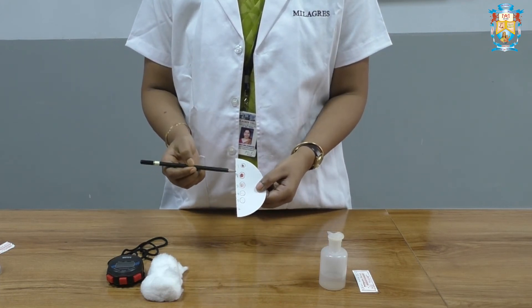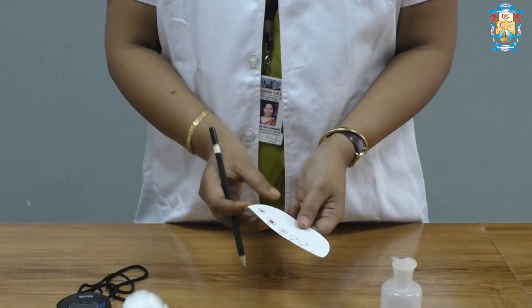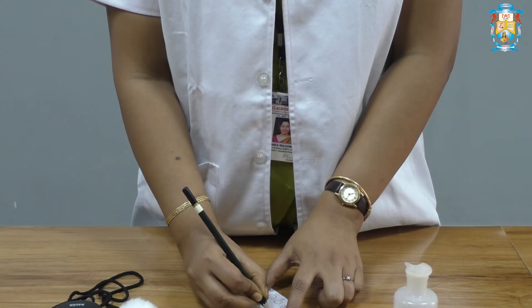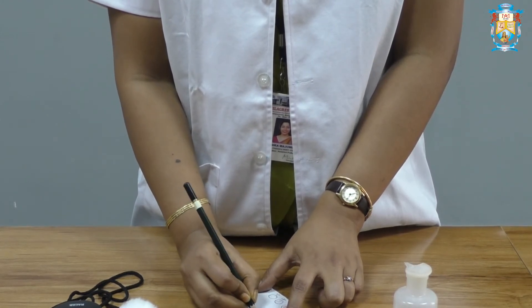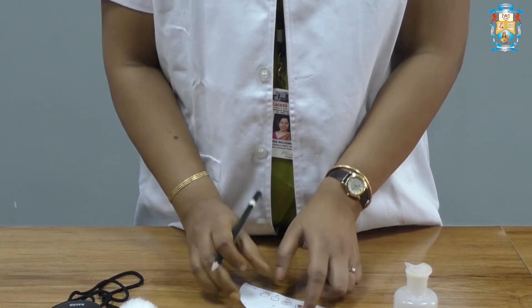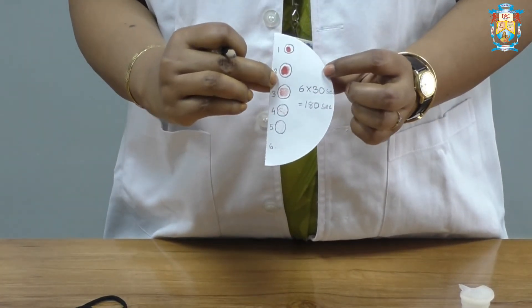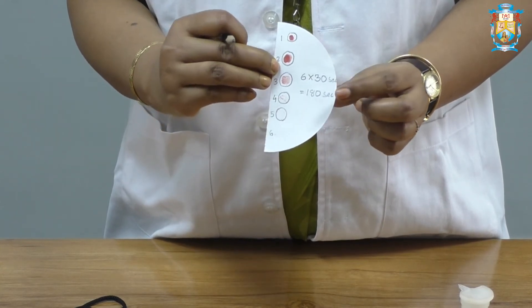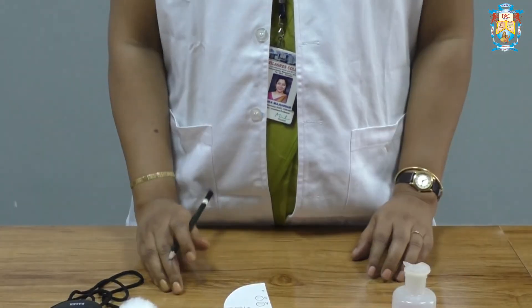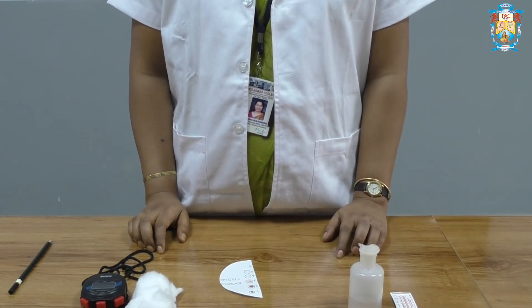Here the number of blood spots are 1, 2, 3, 4, 5, 6. Number of blood spots multiplied by 30 seconds gives 180 seconds. The normal range of bleeding time by Duke's method varies from 1 to 5 minutes.